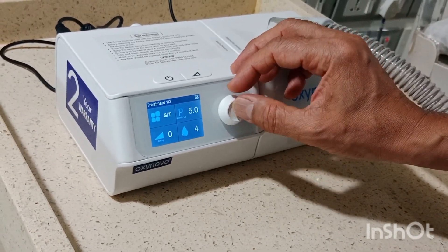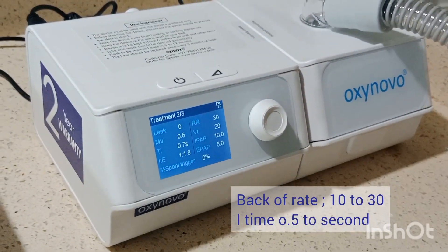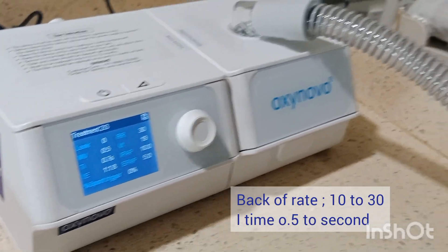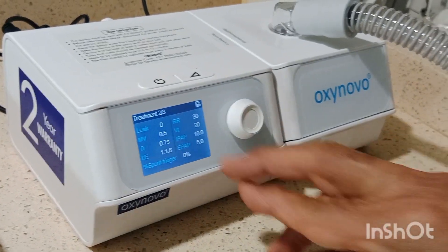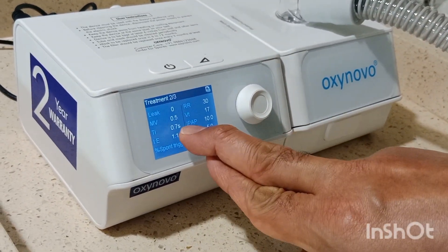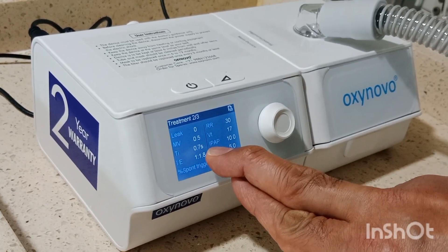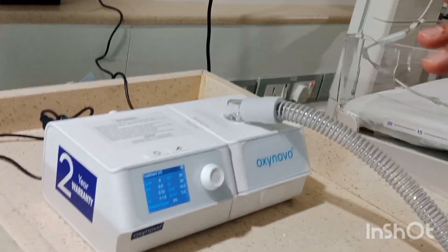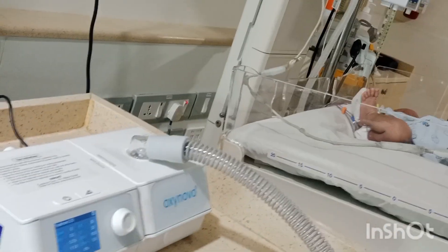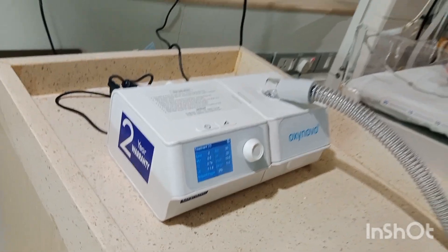When we deliver bi-level to the baby, we keep a rate of 30 — it can be set between 10 and 30. Inspiratory time is kept between 0.5 and 1 second; here we have set 0.7 seconds. This is a backup rate, meaning if the baby doesn't breathe, a breath is delivered — that is why it is called spontaneous and timed.